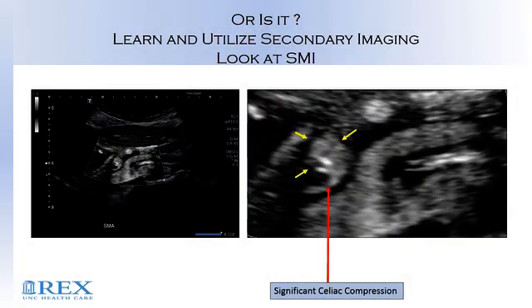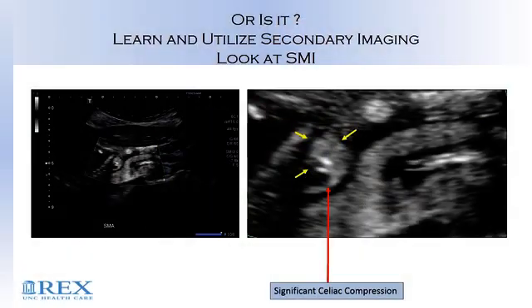Here's a case where it made a huge difference. This is SMI. See this compression with the red arrow here? This is significant median arcuate compression. And if we look at angiography, think about what we see after a significant lesion — post-stenotic dilatation. Look at what happens after that lesion — see where those yellow arrows are? That's post-stenotic dilatation. This person then went for the release procedure on the median arcuate and fared out very well. If I didn't use that imaging parameter, that person would have still been labeled with a conjoined trunk. Little things in our examinations make big differences.